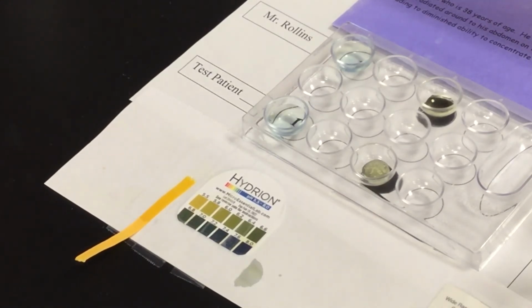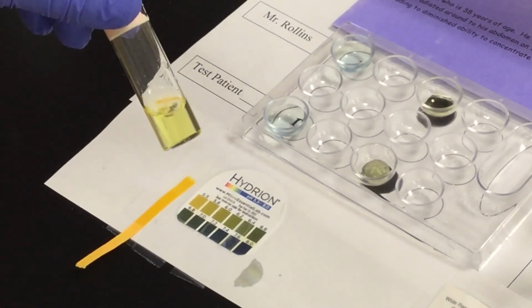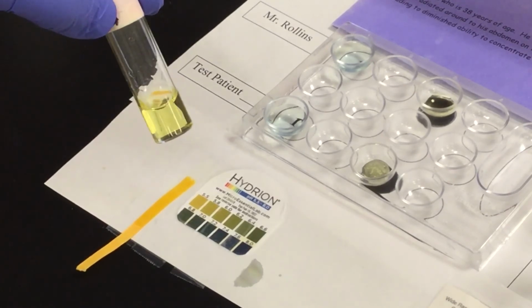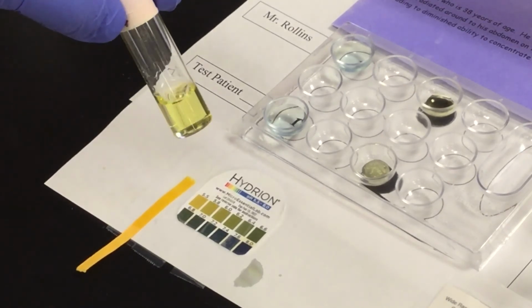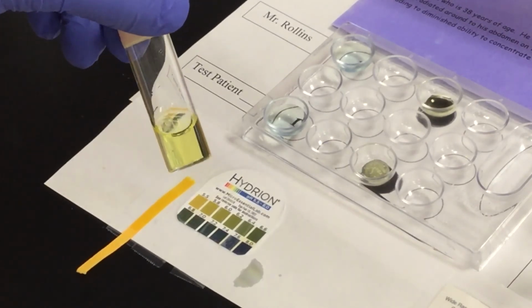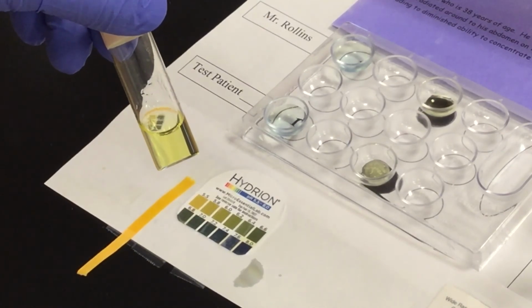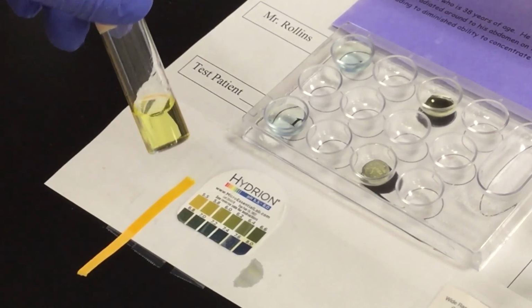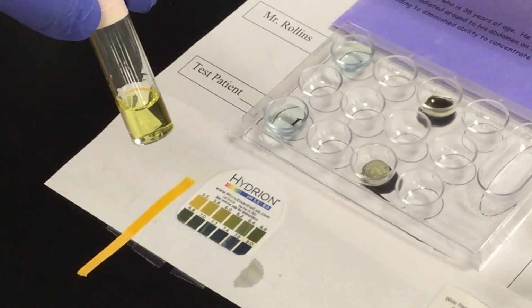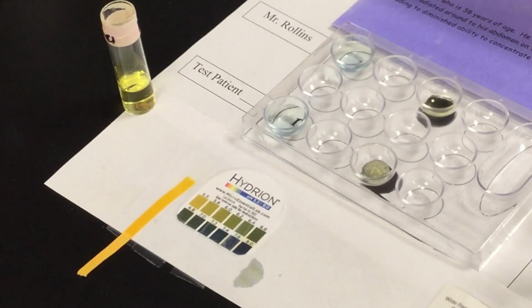Look at our urine sample here, trying to hold it against something white, and pick out your color and your clarity. Compare it to maybe what you saw with Rollins. On clarity, are we able to see through it, or are we looking at some sort of turbidity? It's going to be a little cloudy to see through, and that's why I'm holding it up to the white for you. Think about color-wise, what color do you want to call it? So those are the tests that you have for patient number 4. You will go online as well and look at the microscopic view of those particular crystals, or see if there are any crystals or anything there as well.